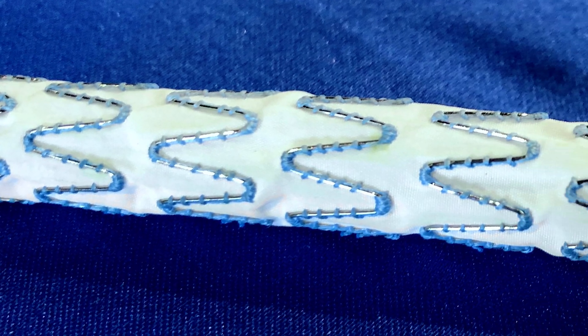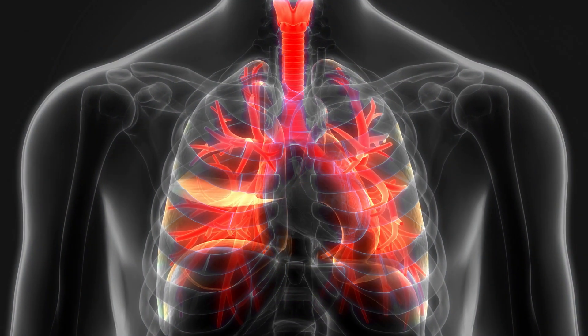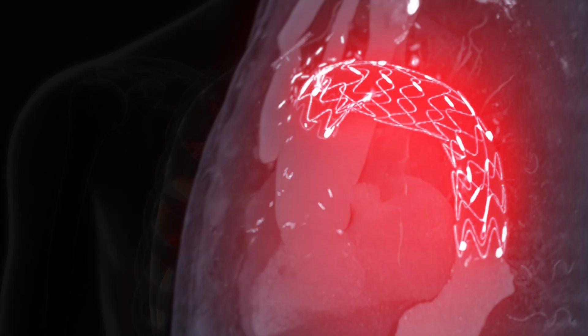These grafts are often produced through cumbersome and labor-intensive processes such as cutting, sewing, and gluing to reconstruct vascular, respiratory, and other channels that can often become damaged.